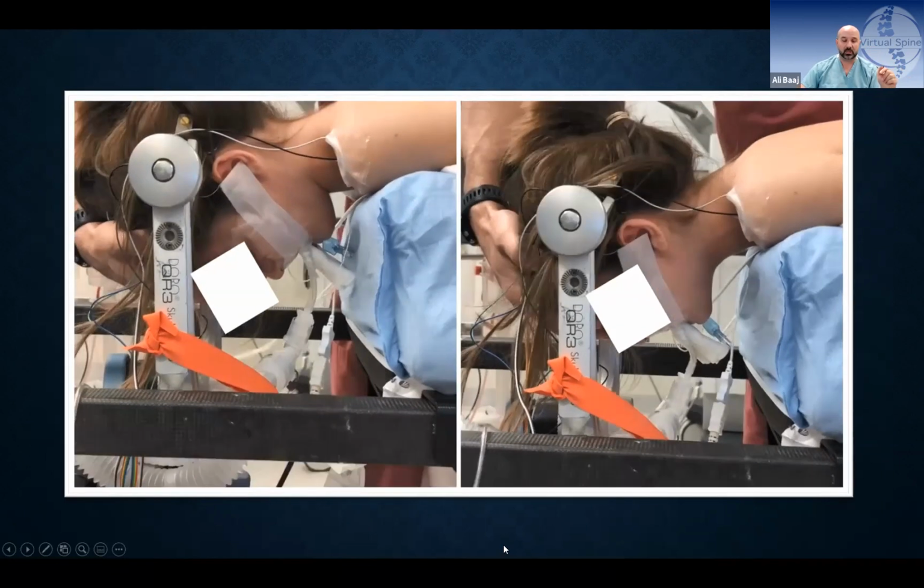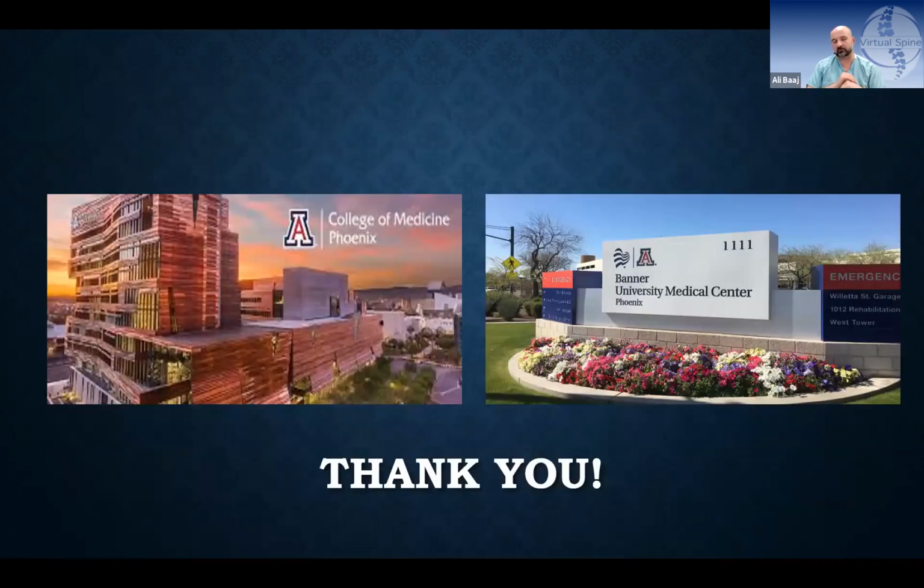So I just wanted to share with everybody a few pearls and techniques that have evolved over the past few years in my own practice and how I look at the OC junction. But again, the big points are: make sure you have a backup plan. Make sure you know the detailed anatomy, especially in a complex case. And number three, look at different parameters in the OR to make sure you're not fusing in flexion, which is more of a problem than fusing in extension. When you fuse somebody in extension, they can usually accommodate for that with their subaxial spine. It hurts, but they can accommodate for it.